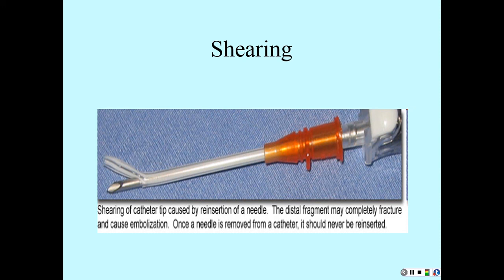I think about some of these IVs that are started in the field by EMS. It's very hard to be very aseptic in a ditch. It really is. They've got to have the IV, but that's really not the upper part of their thought processes at that point. They just got to get the IV in and get their patient resuscitated or fluids or whatever the reasoning is. But you have to watch that. And sometimes I have seen IVs started and they actually get up to the floor and they've got grass under the op site.